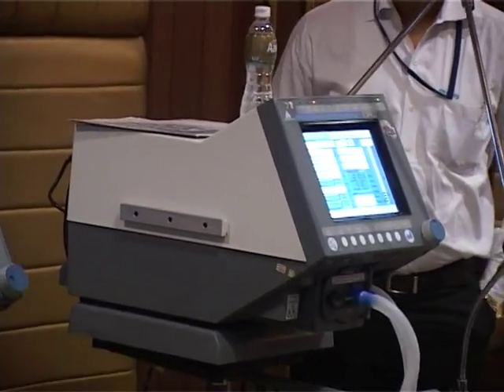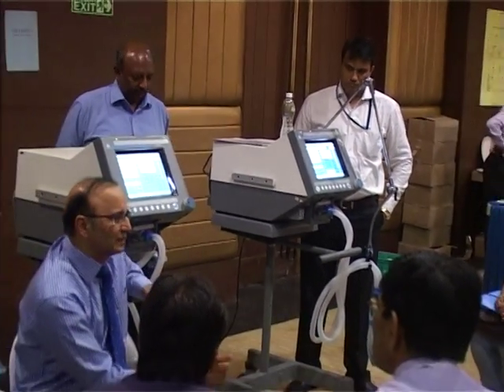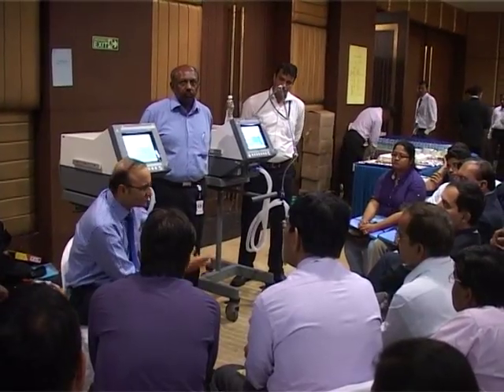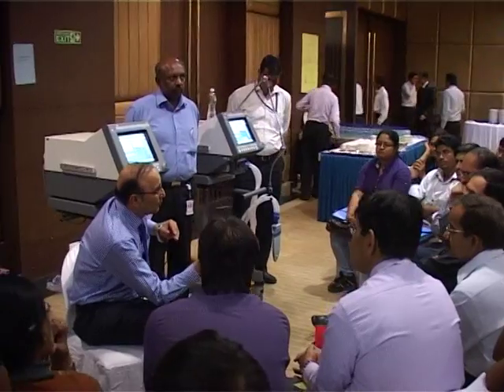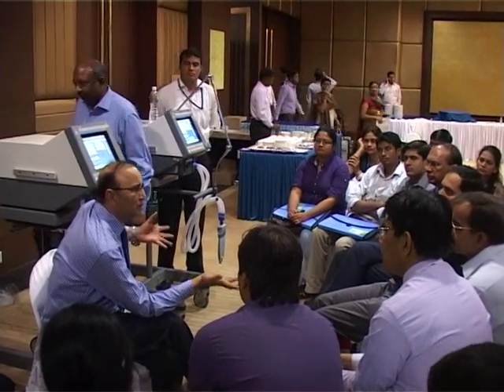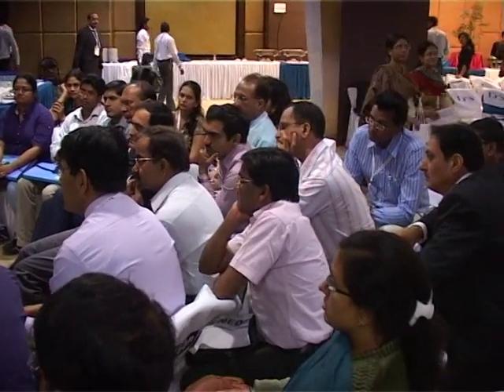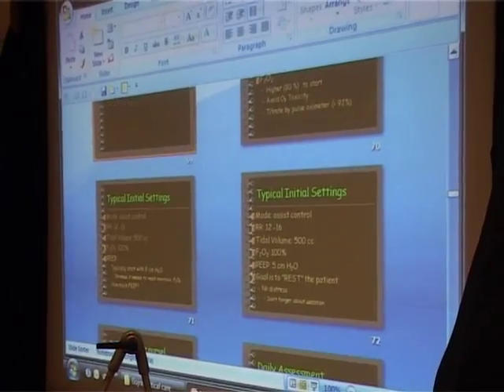The newer ventilators, they don't write down the times. They will only write down I:E. But roughly you know that this much you give, that will be the flow. Okay? So you give a flow to the patient, and when you fix 500 ml, when the 500 ml inspiratory volume is reached, this is a volume control. Time triggered, like I fix 12 breaths per minute. So every 5 seconds, the inspiratory valve is opening and you are ventilating the patient.